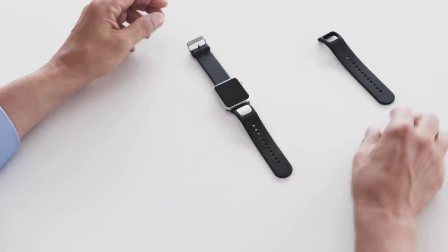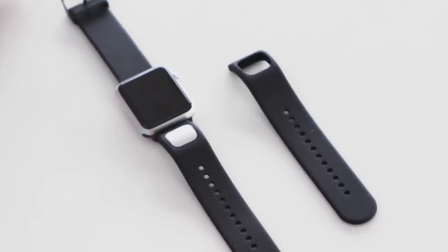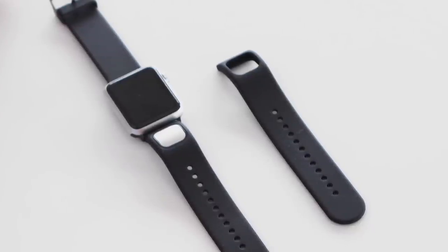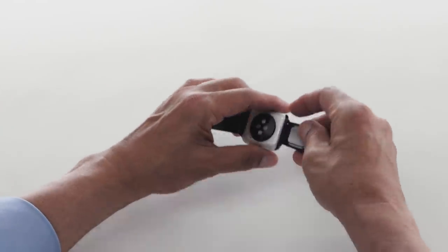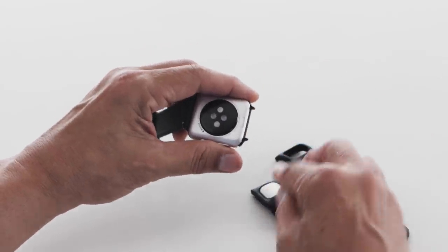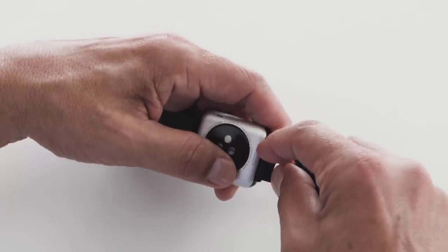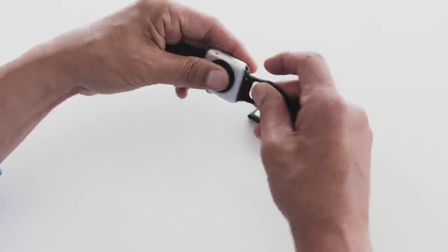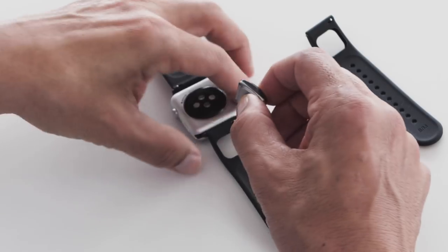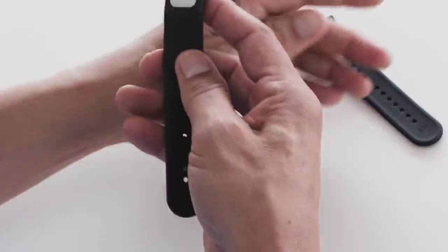CardioBand comes with two length options for the lower strap. The short strap comes with the sensor and adapter pre-installed. To use the long strap instead, compress the spring bar to remove the adapter from the short strap. Then connect the adapter to the spring bar that's pre-loaded into the long strap. Now just slide the strap into your Apple Watch. Then transfer the silver square sensor into the long band. It's that easy.